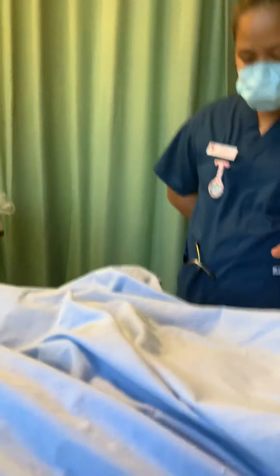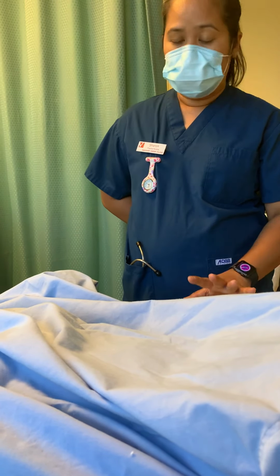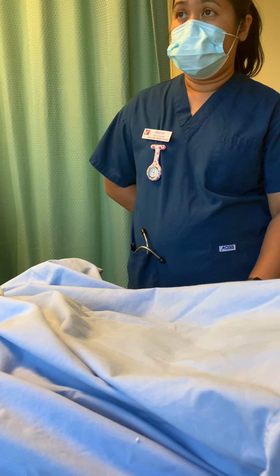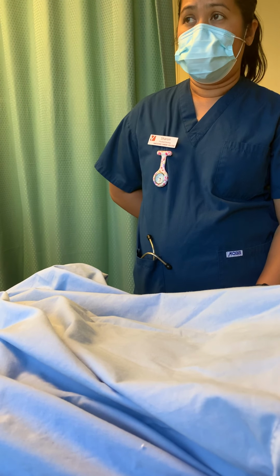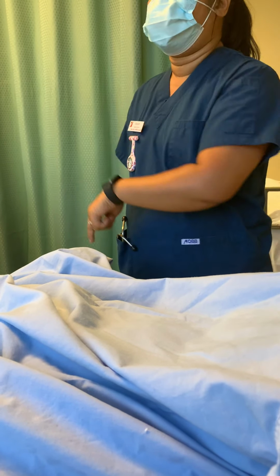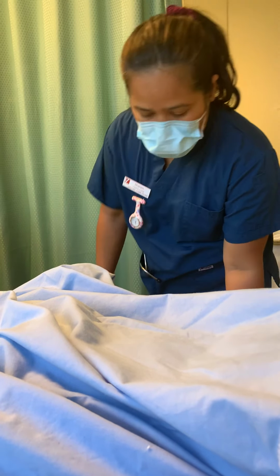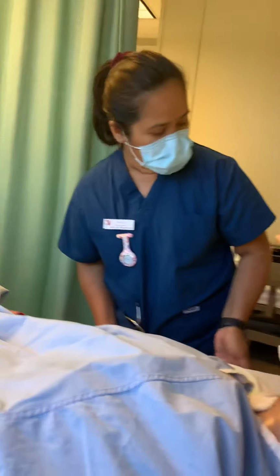So while I'm assessing him, I have to do the catheter, right? I don't want to do the bubbly. I'm done with it. Everything. For David, you're doing David. David is male. No bubble here. No bubble. So I have to do the assessment. And then the catheter. I want to do the catheter now because I'm done. No, you haven't done the assessment. Okay. So I'm going to tell him that I have to assess it.